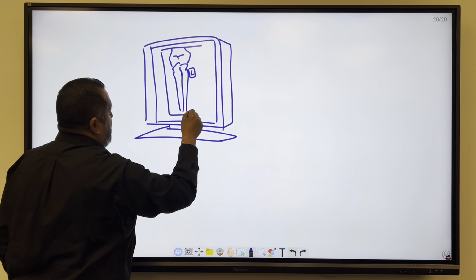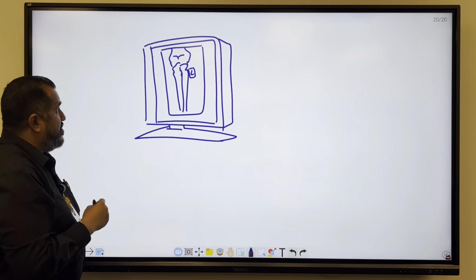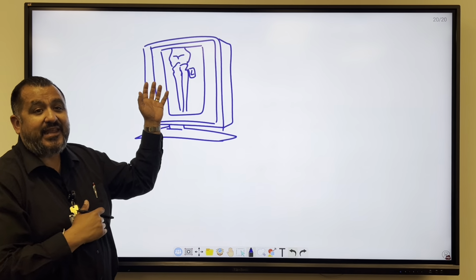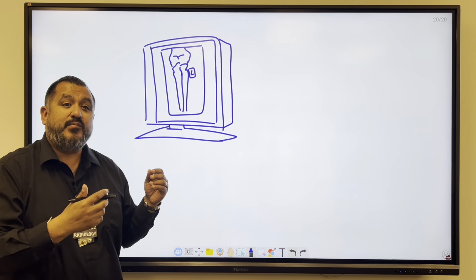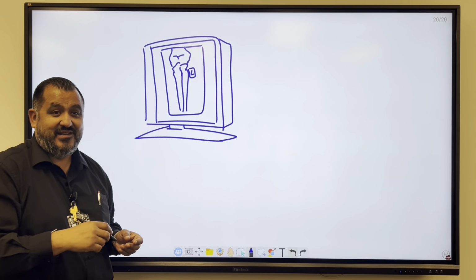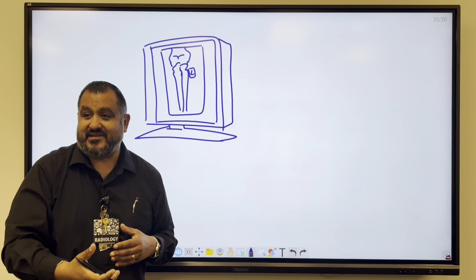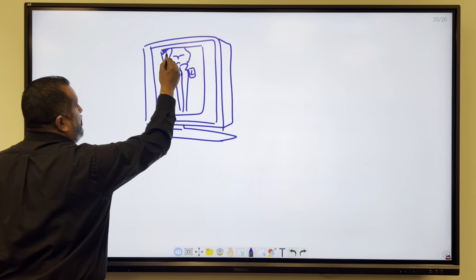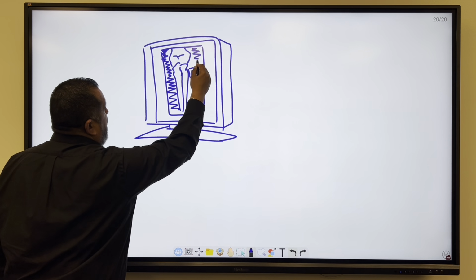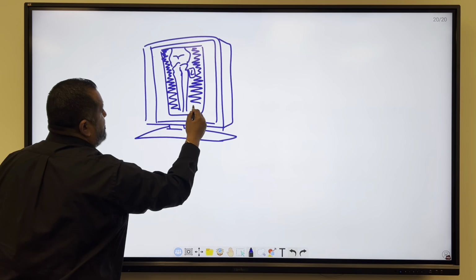We're collimated, right? So when you have the area behind the anatomy blackened, you have a blackened border, that's going to be known as shuttering. So shuttering is a post-processing that we have now. When you have a blackened border behind the object, that's known as shuttering.